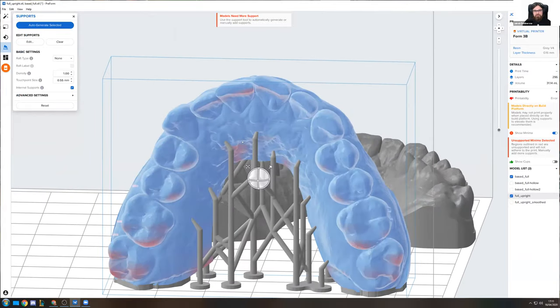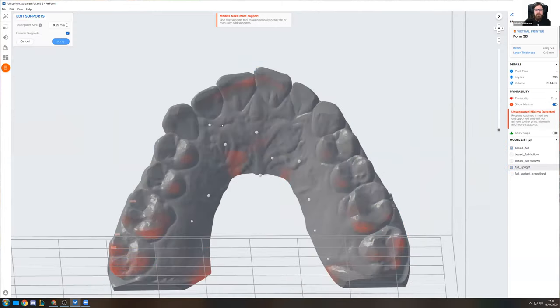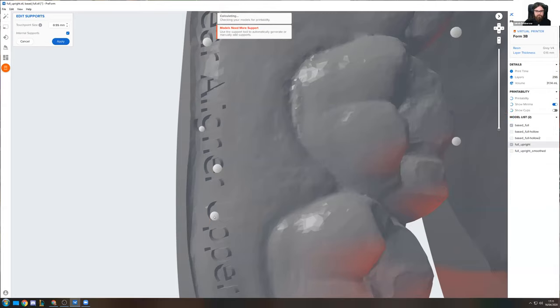And if I know I want my aligner to go a little bit further down, I can take these supports, go back in, clear them out, and push them a little bit further. Or if I see later that I actually needed a couple more, I can just go in and add the couple that I really need.